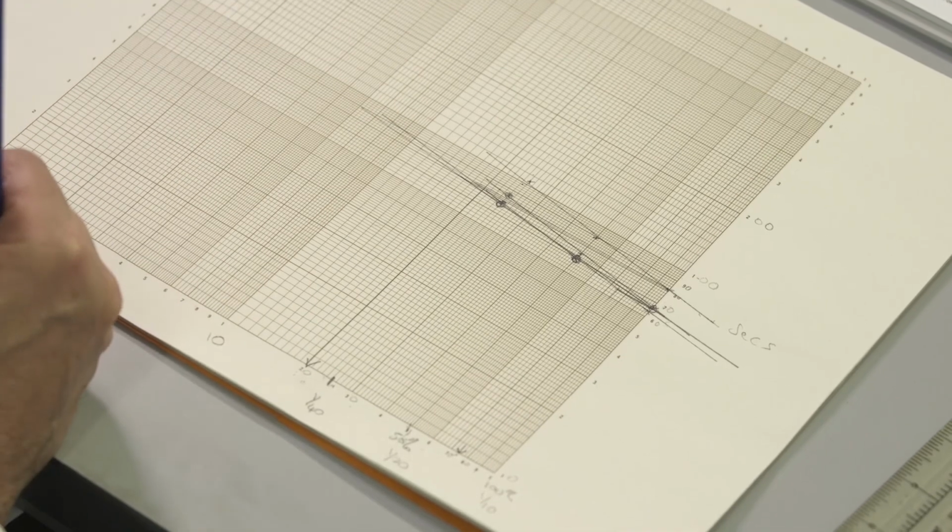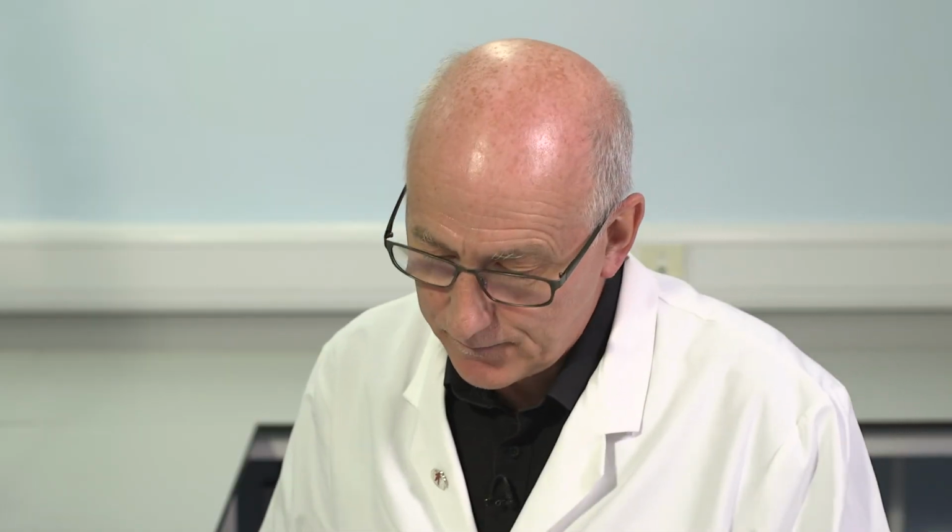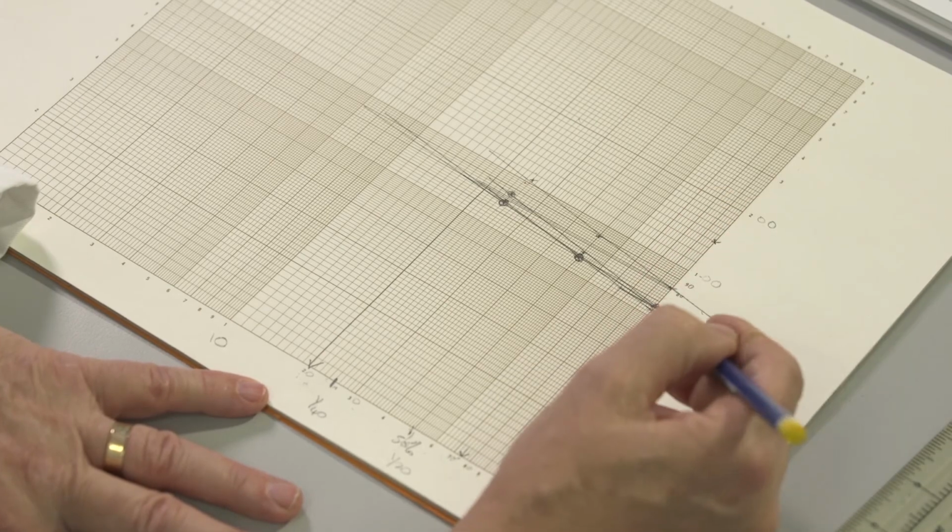And sometimes that effect is much more marked. We can see falsely reduced levels in the first dilution. So I think it's absolutely the reason why we've got to use 3 dilutions. Turning now to the 3rd patient sample. The 1 in 10 dilution, 141 seconds. The 1 in 20 dilution, also 141 seconds.